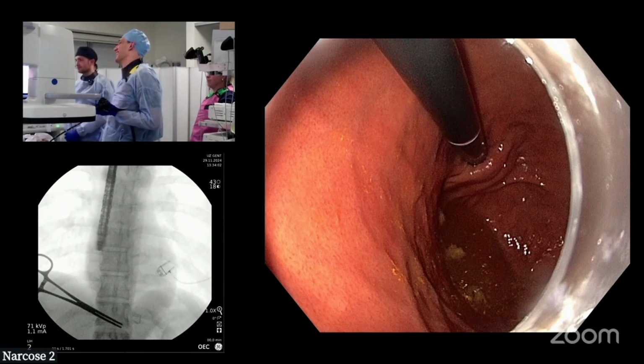Well, we were discussing the EndoFLIP measurements, and I think the surgeon has done a thorough Heller because your distensibility was 4, which is normally our goal. But the diameter was quite small, so I do believe that there's a problem with the fundoplication. Perfect. So for the first time in a long time, endoscopists and surgeons, this is a joke, of course, are on the same page.